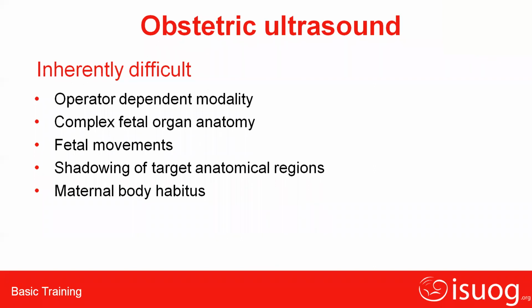Number one, it is an operator-dependent procedure. Unlike in a CT scan or MRI, where the technician captures the image and the next day the radiologist interprets it, here we have to do the live interpretation while doing the ultrasound. So definitely the dependency on the operator is very crucial, and operators should be well trained.